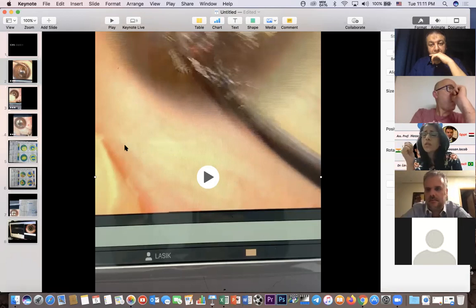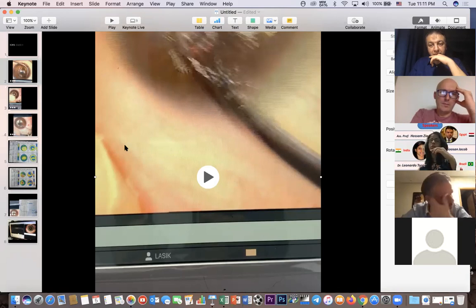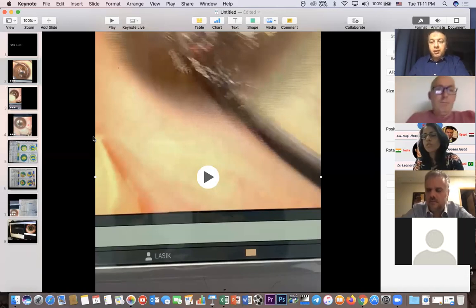Which I call the turnaround technique, where because now you have the femtosecond channel somewhere here and your segment went somewhere else, you cannot possibly go in this direction anymore. So now you take out that segment and you come from the opposite direction, from the other side. The lip that was formed, which prevents it from going any further, is now flattened back when you come from the other side. So stop trying from this side, turn around and put your segment from the other side, and the lip that was formed gets flattened out again. Then you find that you can push the segment in, into the right femtosecond laser track. Okay. Thank you.